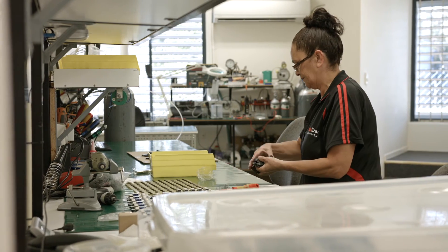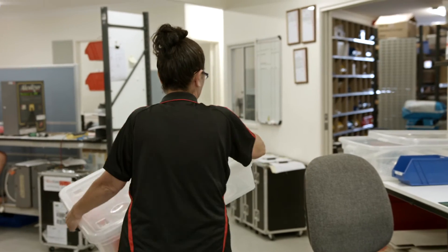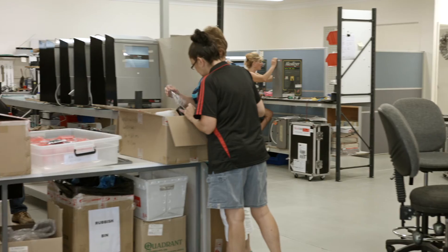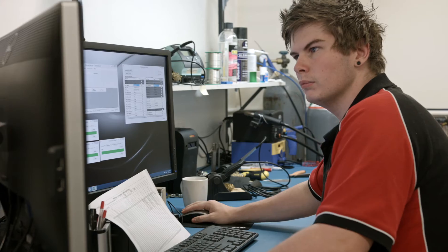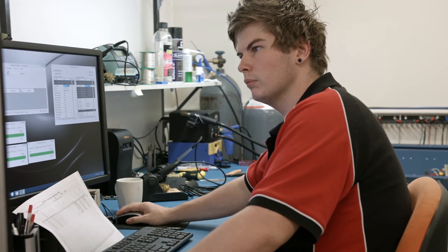Alkalizer's world-class support plan, Alco Care Premium, is a high quality flexible service and support program for all Alkalizer designed and manufactured products. Service is delivered only by factory certified technicians.